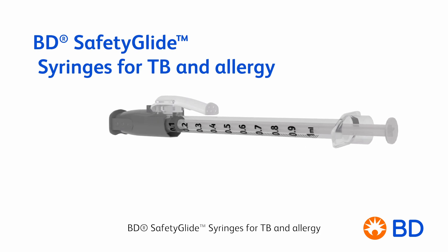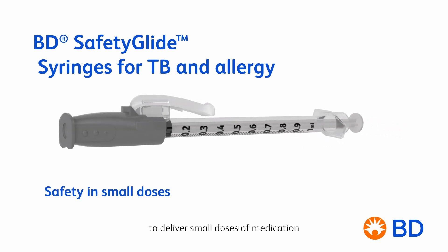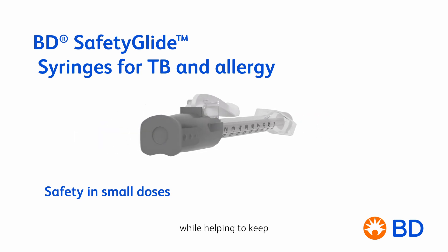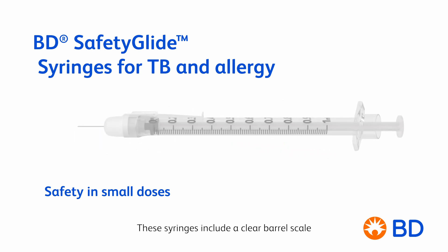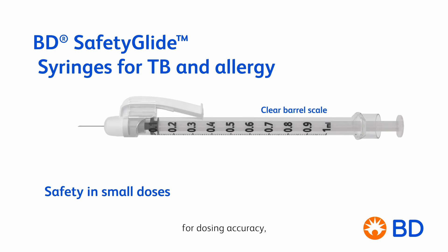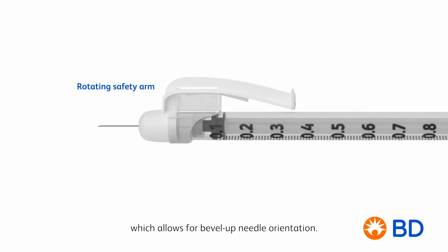BD SafetyGlide syringes for TB and allergy are specially designed to deliver small doses of medication while helping to keep healthcare workers safe from needle stick injuries. These syringes include a clear barrel scale for dosing accuracy and a rotating safety arm which allows for bevel-up needle orientation.